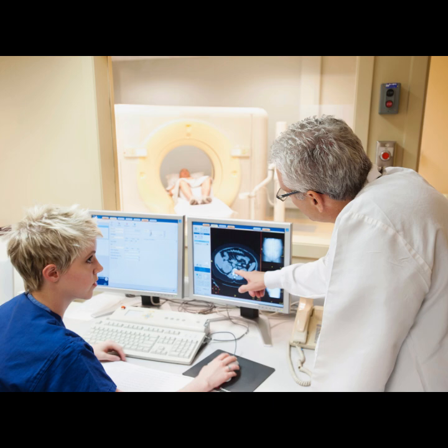I'm not quite convinced by that line of reasoning. Upgrading every single scanner in the field to support custom, high-speed parallel NUFFT, that's a monumental logistical hurdle, not to mention regulatory. Let's maybe set aside the hardware arguments for a moment and return to the fundamental physics of decay, because I think this is where the classical approach truly shines. The spin echo sequence, using that physical 180-degree inversion RF pulse, is an elegant solution precisely because it actively reverses the phase defocusing effects caused by static field inhomogeneity.